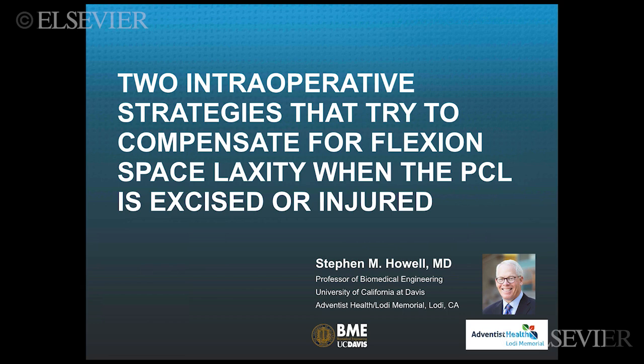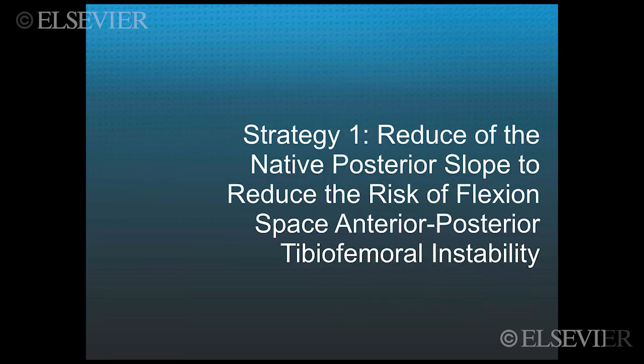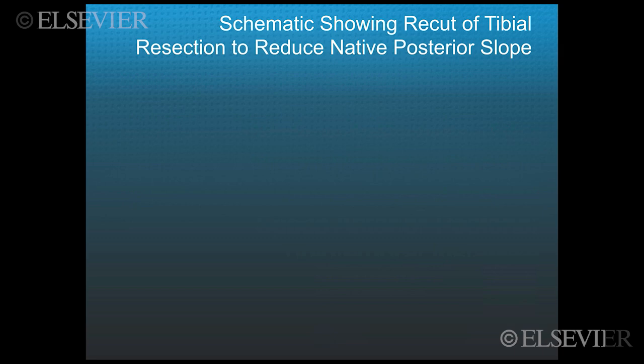Now let's examine two intraoperative strategies that try to compensate for flexion space laxity when the PCL is excised or injured. Strategy 1 is to reduce the native posterior slope, which reduces the risk of flexion space anterior-posterior tibial-femoral instability.